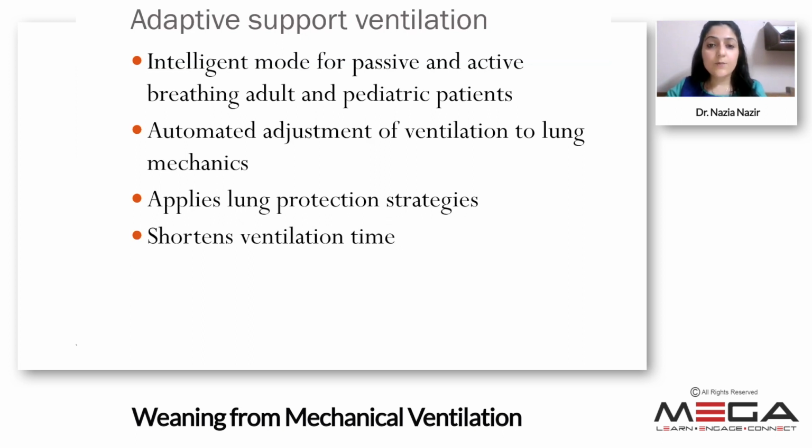It is an intelligent mode of both active as well as passive breathing for adults and pediatric patients. It automatically adjusts the ventilation to the lung mechanics as well as applies the lung protection strategies. So this helps in shortening the ventilation time and has been seen in the Hamilton IntelliVent ventilators.